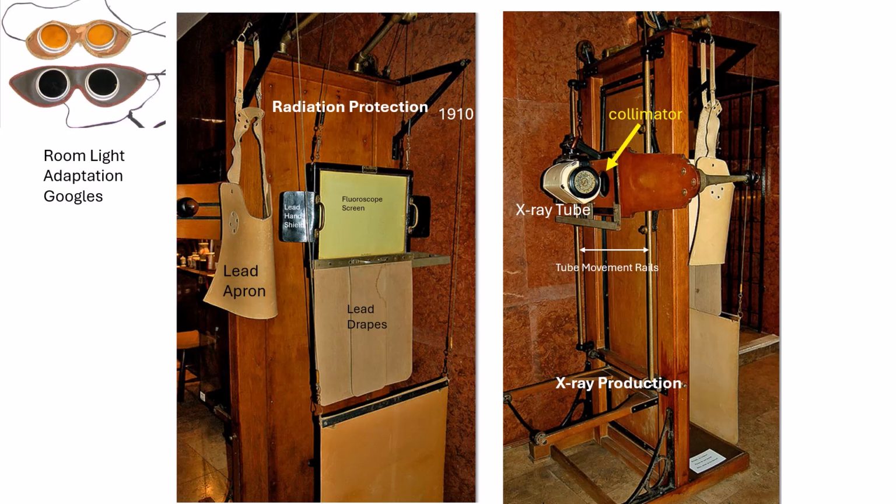On this particular system, it is designed so the patient must move if there is to be any motion as far as the geometry goes, and the radiologist can move the fluoroscope up and down the patient on a track.